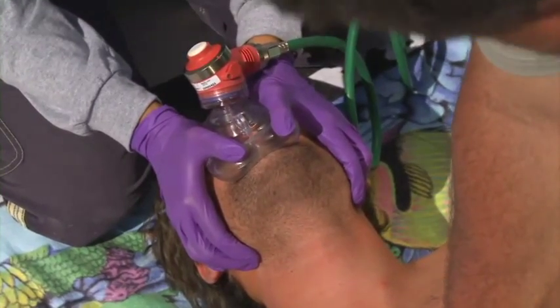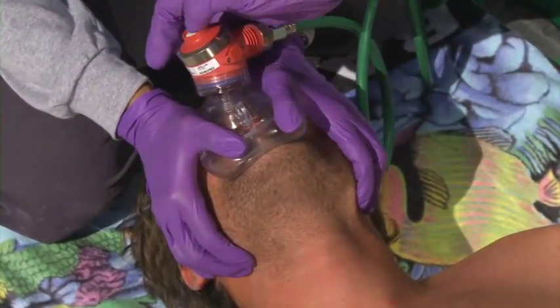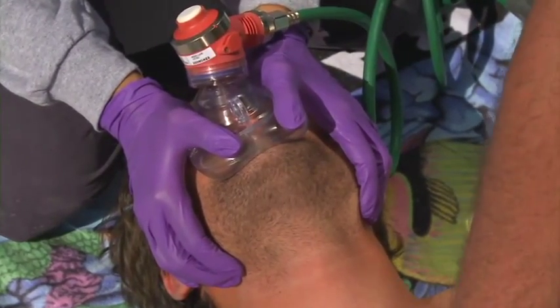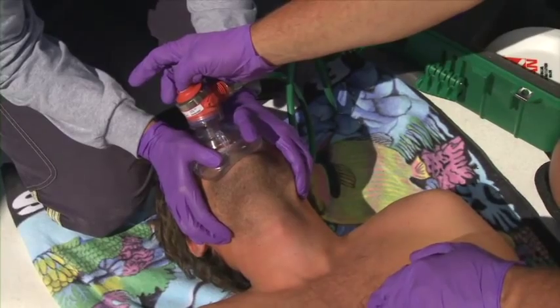The most common problem with using this device is failure to create an adequate seal of the mask on the patient's face. Make sure you lift the jaw into the mask and seal the mask with firm, even pressure. If you are unable to create an effective seal, consider using another ventilation device.